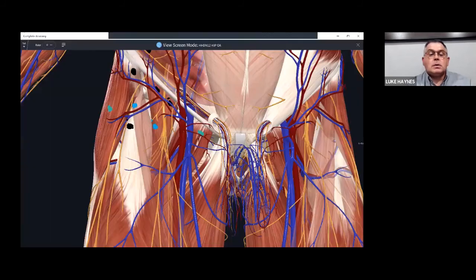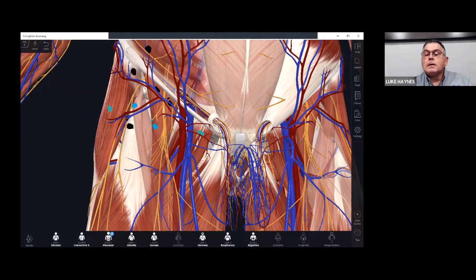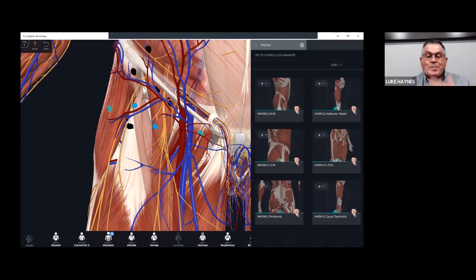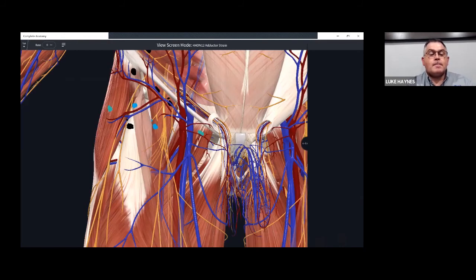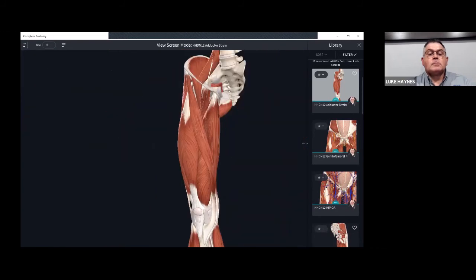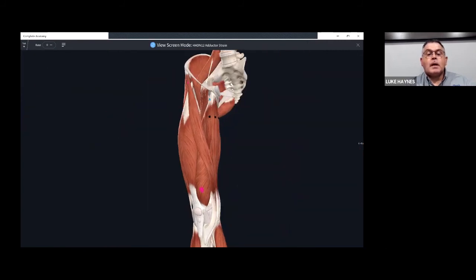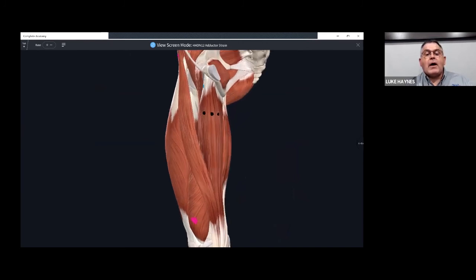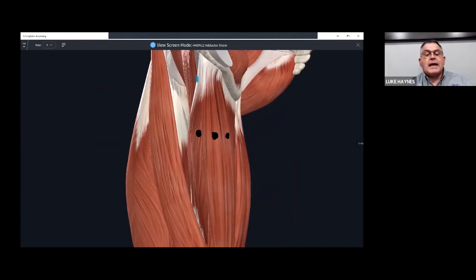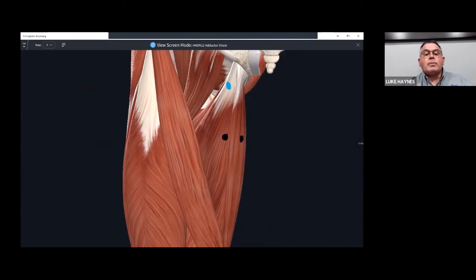Try adductor strain. Okay, so remove the other leg. So very first one, our adductors. Gracilis, adductor longus, adductor magnus, 4 finger breadths from the pubis, insert needles, and then direct them towards the table.